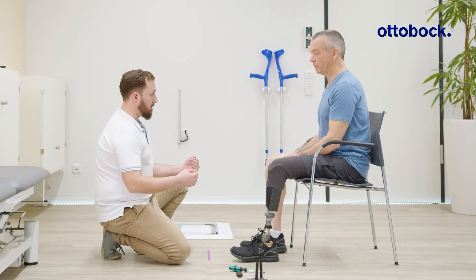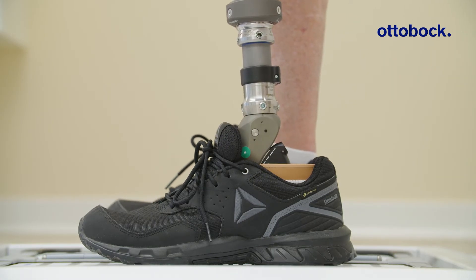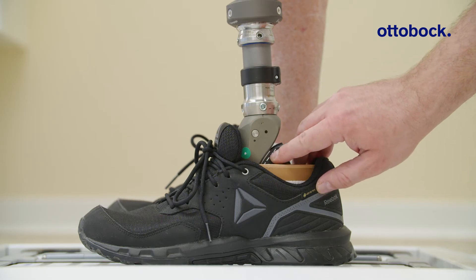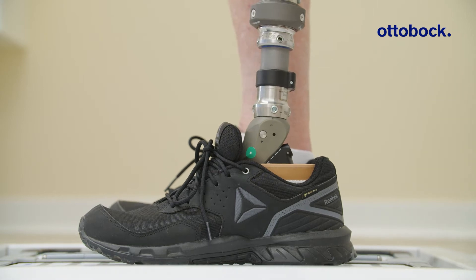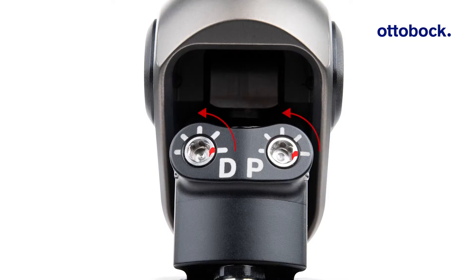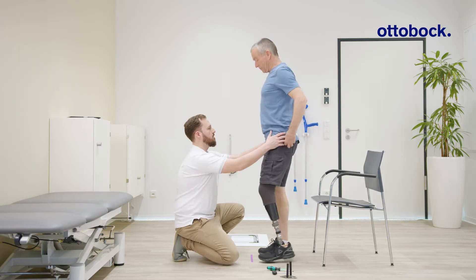The static alignment optimization ensures that the basic prosthetic alignment fits the user properly. The goal is to have the user standing balanced while the teleo adapt is in the neutral position. When this is achieved, the user will stand comfortably without compensation and make optimum use of the hydraulic range of motion. First, set the valves back to the middle of the hydraulics ranges. Next, verify the correct length of the prosthesis.